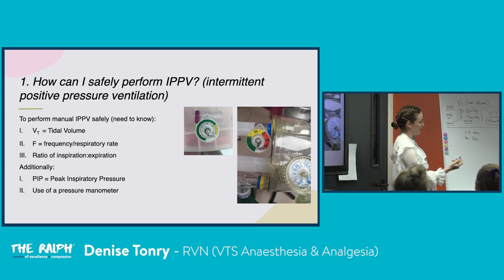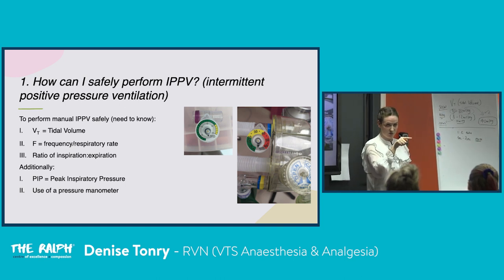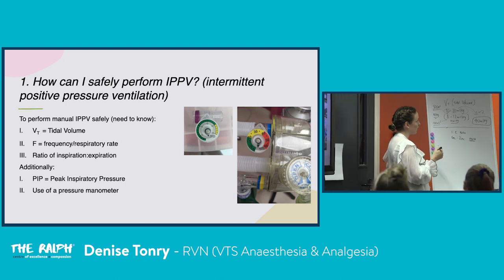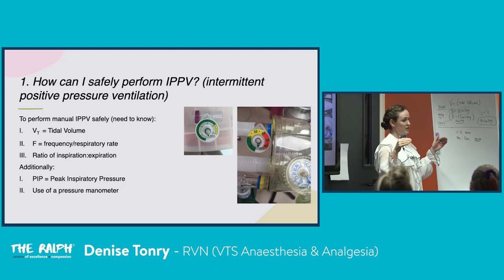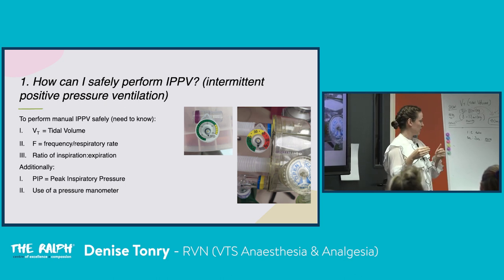And a natural thing is to have a pause. Most humans, most animals, they take a pause. You see your capnograph line is zero, and then they exhale, then they inhale, and then it's zero because they're doing this natural pause. I think it's important that we match that as well. We're already changing quite a lot by providing positive, increasing intrathoracic pressure, affecting blood pressure, that we try and match their natural physiology as much as possible.